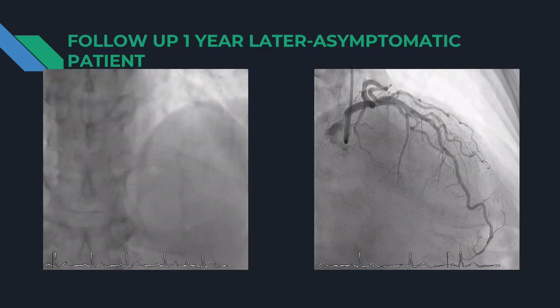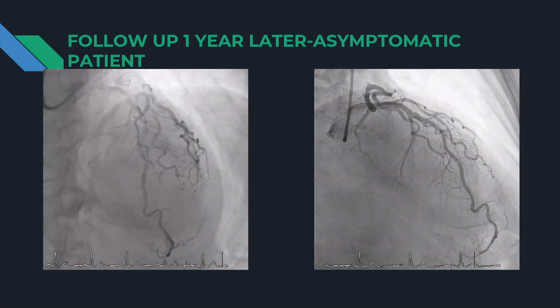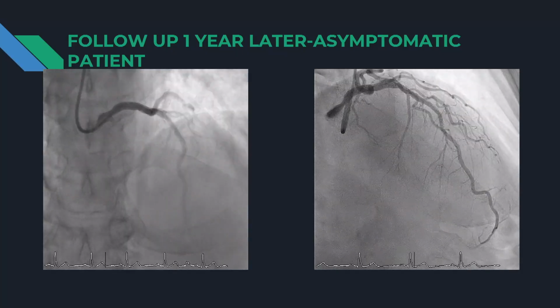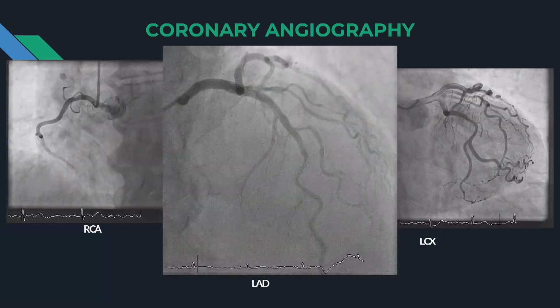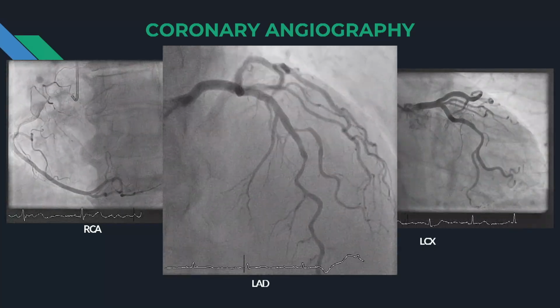Well, supposedly, in theory, this stent preserves the normal vasomotion. I'm not sure. We don't know. If you say it was already a tortuous vessel, I think I have no experience with this stent, but in my view here, especially in the RAO, you can see that it follows the vasomotion of the vessel. There is some intimal hyperplasia, also imaging has shown us. But the patient is asymptomatic. I think you did a great job.